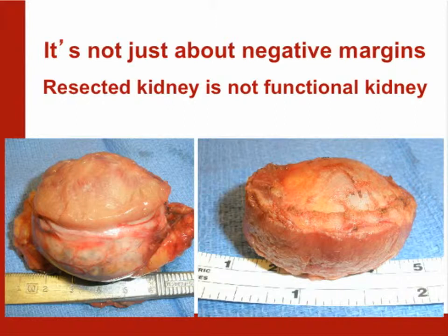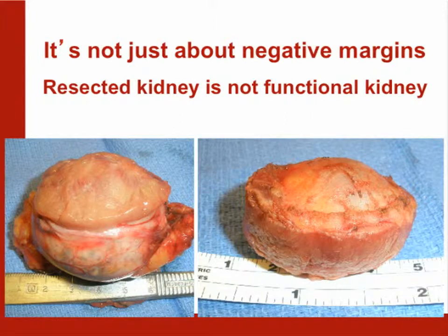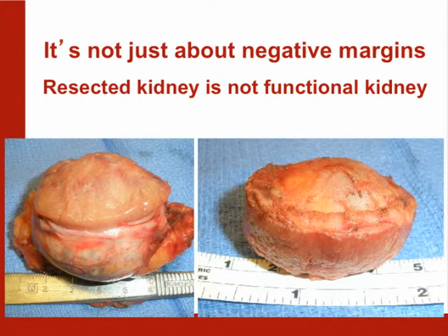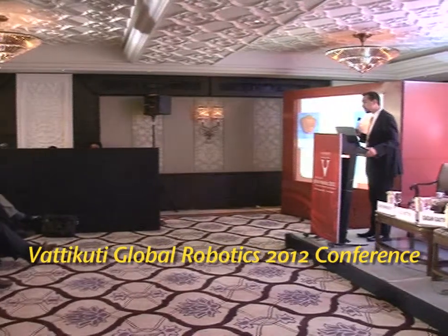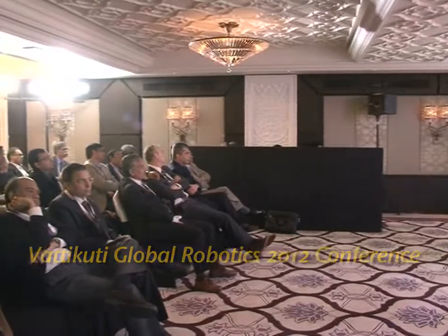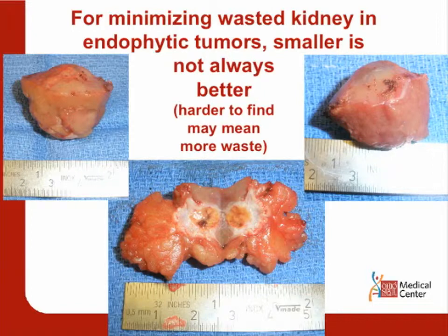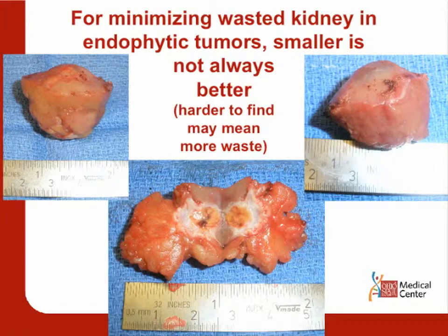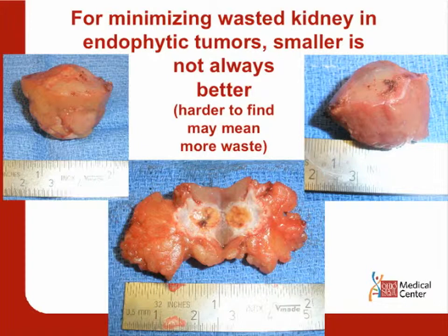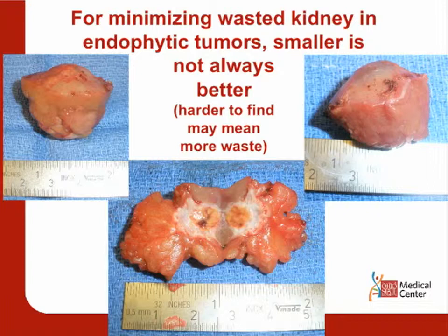Robotically, it's beautiful that we can tailor our margins. If we want 2 or 3 millimeters of margin, we can do that. Here's a more endophytic tumor where we can get a very tight margin without wasting a lot of normal kidney. With completely endophytic tumors, smaller is actually not better — it's a little easier when the tumor is larger. When the tumor is very small, like 1 or 1.5 centimeters, and completely endophytic, it's actually harder to save normal kidney. You end up wasting more kidney than you need to.